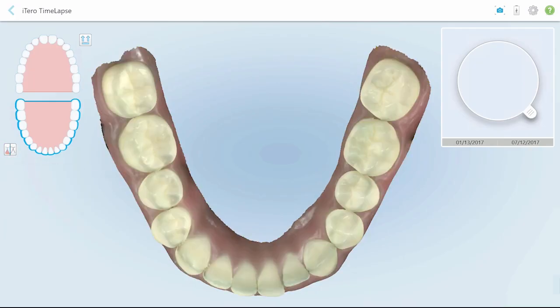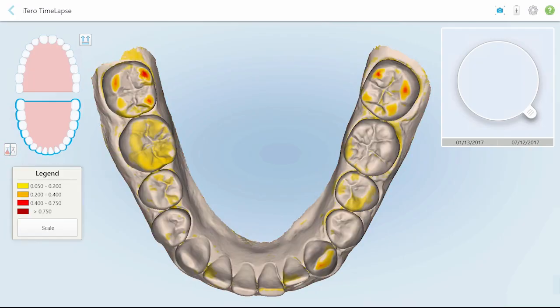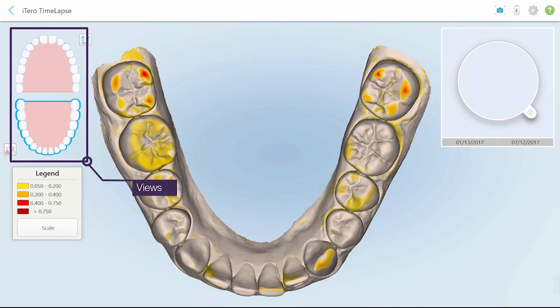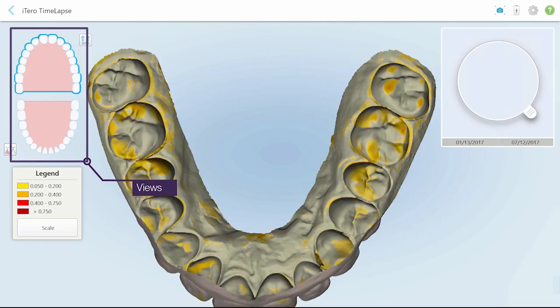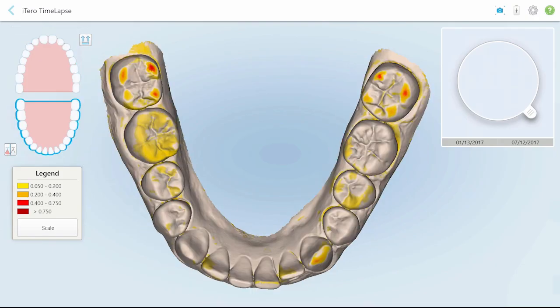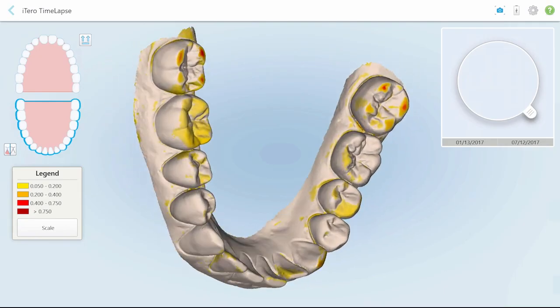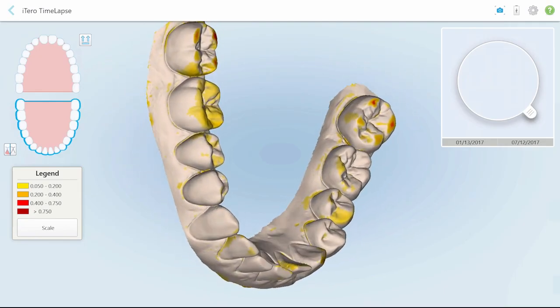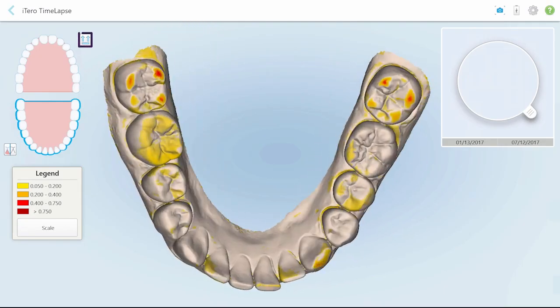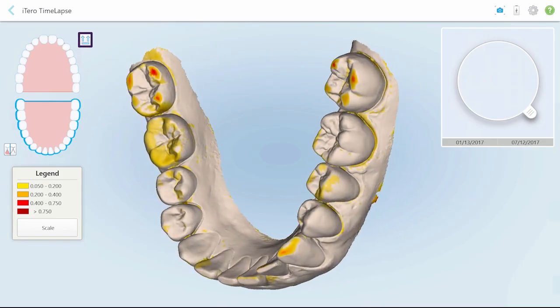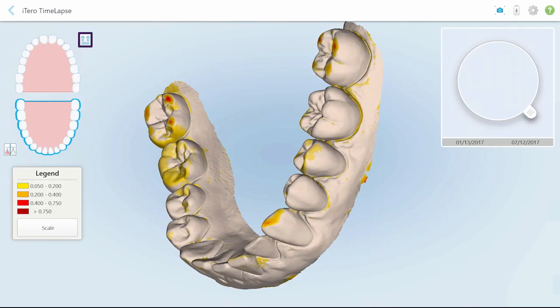Tap here to toggle between the monochrome view and the color view of the scan. The differences between the scans are highlighted only in monochrome mode. Tap on the model diagram to view the upper and lower arch.